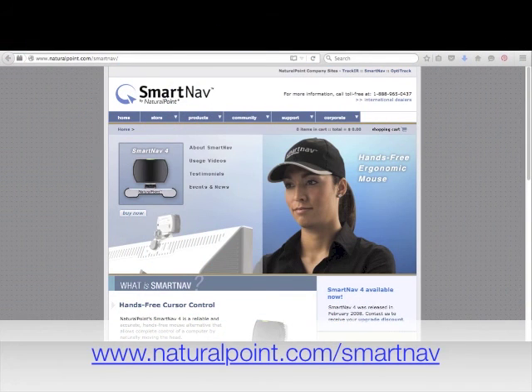For more product information, tutorials, troubleshooting, or to purchase the software, you can visit the SmartNav by NaturalPoint website.